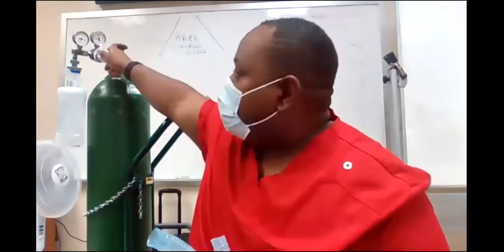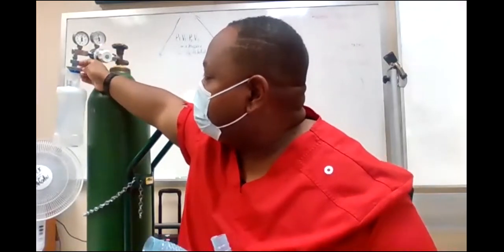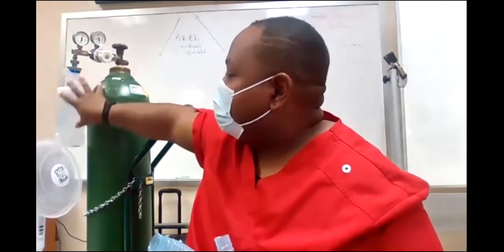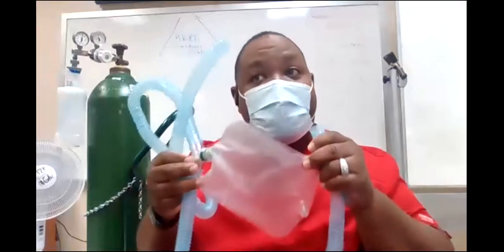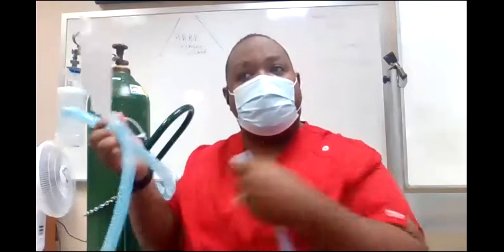So your parts to the high flow system, as far as the aerosol is concerned, see that? The parts will be the large volume nebulizer, right, which has the Venturi Principle and the Bernoulli Principle for that tubing inside of there, okay? The large volume nebulizer, one large bore tubing, then you have to have a reservoir bag or water trap, water bag, whatever you want to call it, and then another large bore tubing, and then whatever you put on the end is what it is, okay?